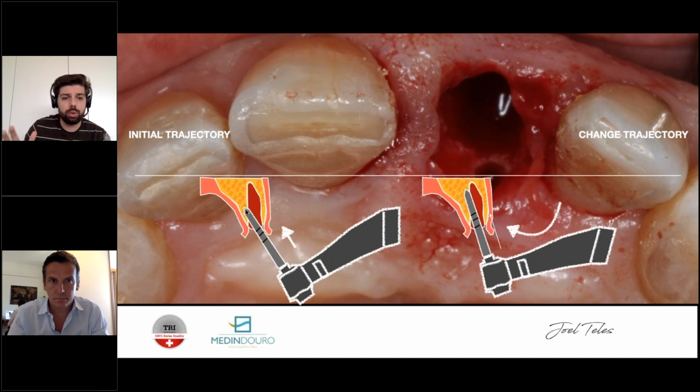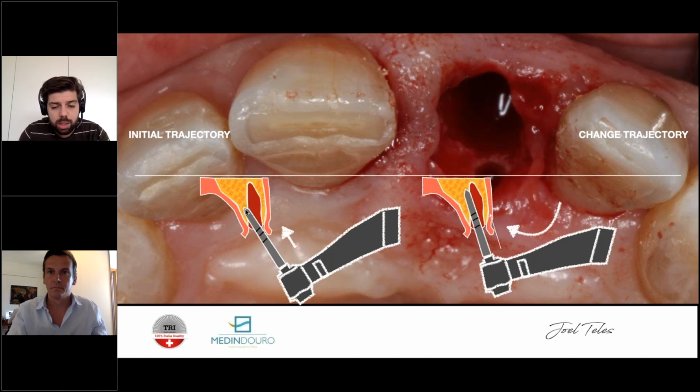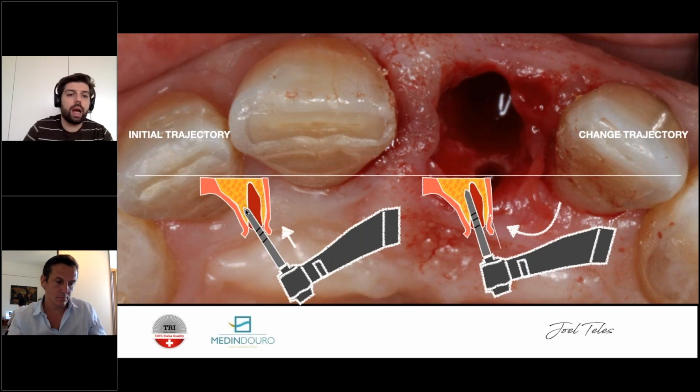Afterwards, you can go directly because you already created the path. But for these 2 drills, it's very important to do it exactly like this. The only tip is that your hand needs to be steady, because once you try to puncture that palatal side of the socket, it tends to push you the other way around. So puncture it perfectly. That's why the 45 degrees is helpful. So you puncture it and then start to reshape. This is the puncture that you see here on the image in the background, showing you what you create, and then you change in order for the implant to be in the right positioning.